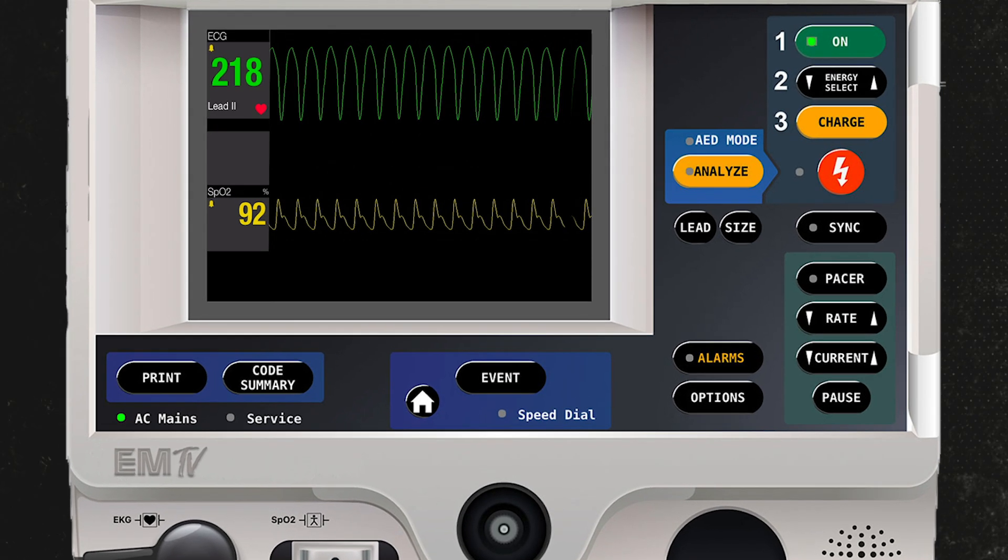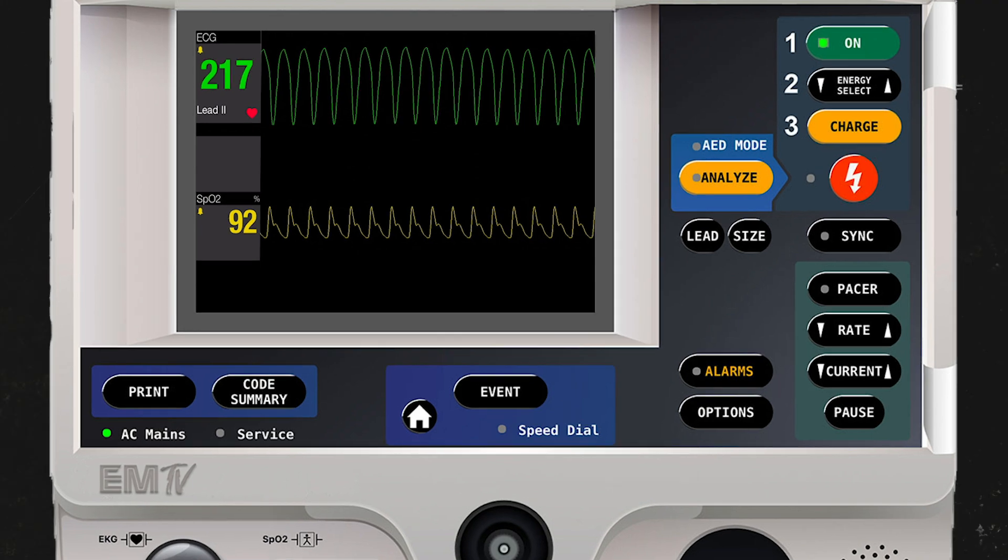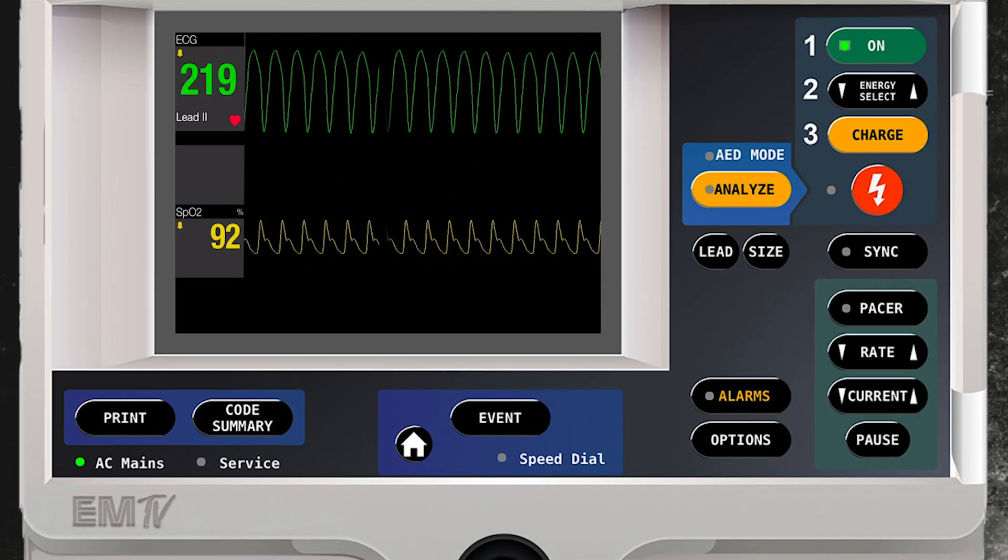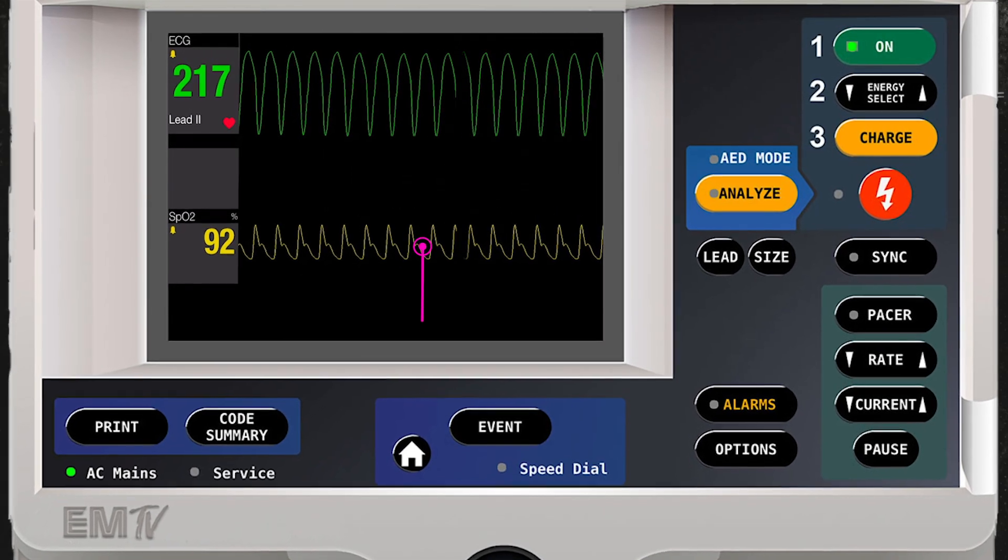My patient happens to be in VTAC, but I can tell that it has a pulse because the patient has an SpO2 pleth.